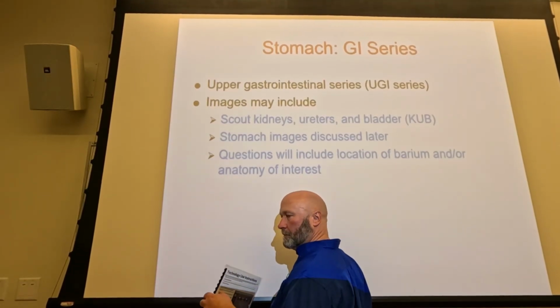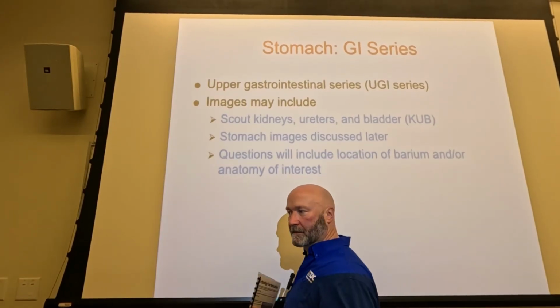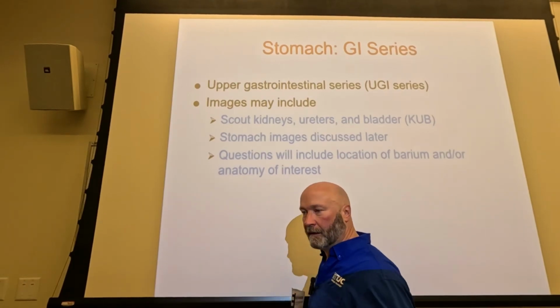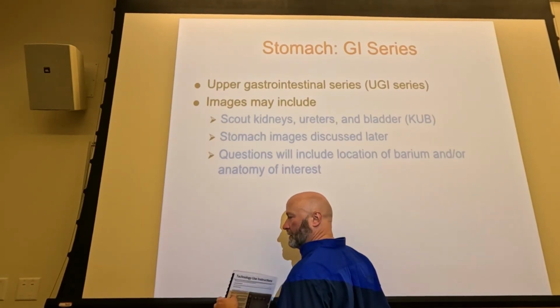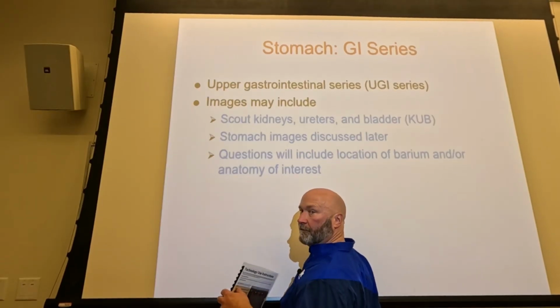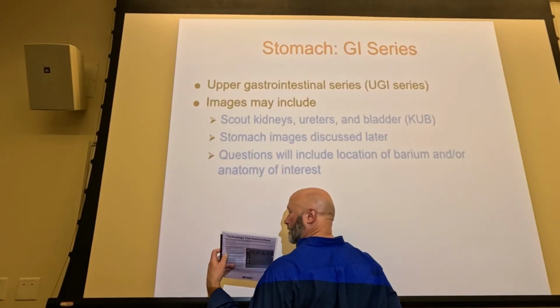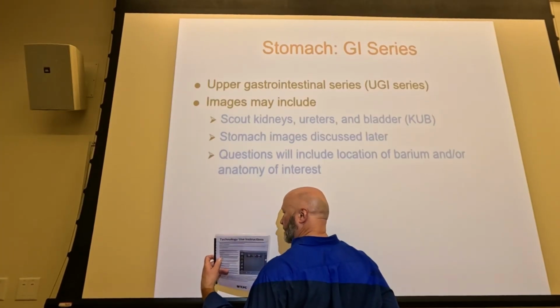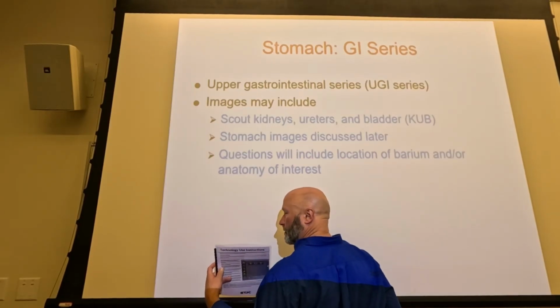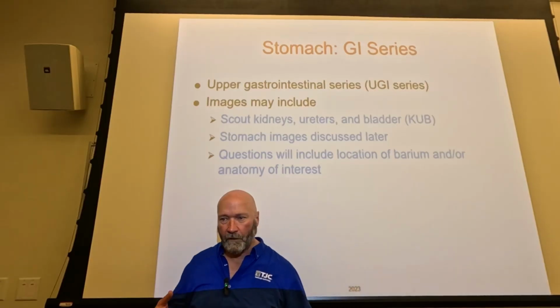RAO. Fundamentally, is there going to be a whole lot of difference between this and this? No. So where's the air going to be in this? Probably greater curvature, some in the fundus. PA, where's the air going to be? Fundus. And the body is going to be full of barium. So just think gravity.